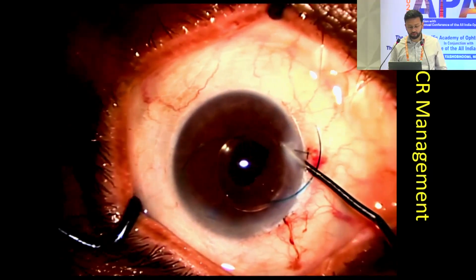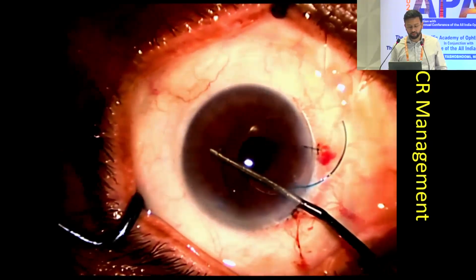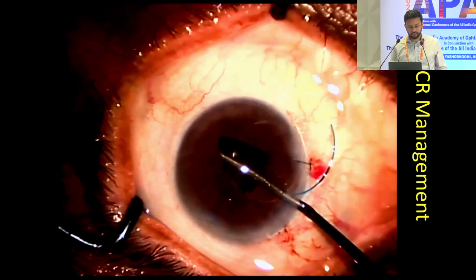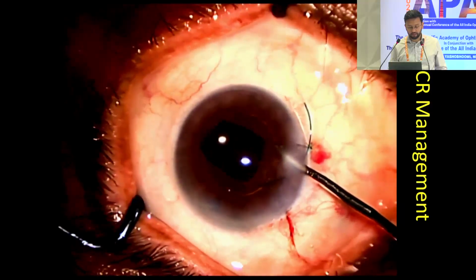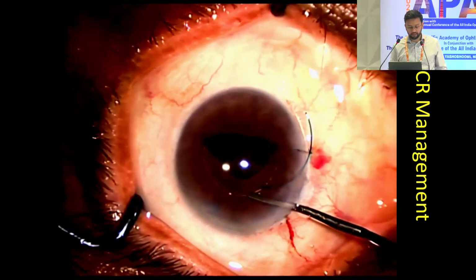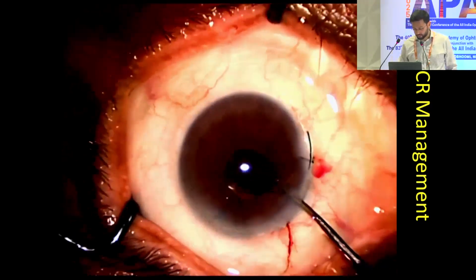Here, because there was good anterior capsular support, we are attempting to implant it into the sulcus. So carefully sliding the leading haptic first inside, ensuring that it is in the sulcus, then we can slide the rest of the lens. Placing the optic under the iris and then gently rotating the lens into the sulcus.